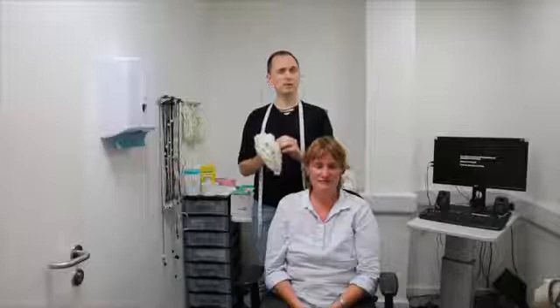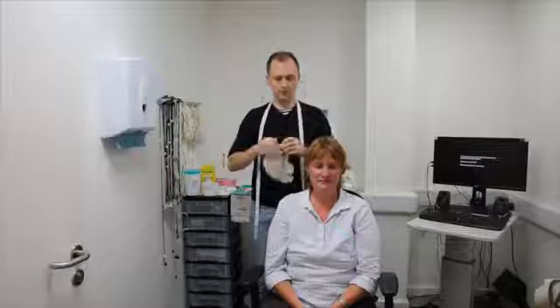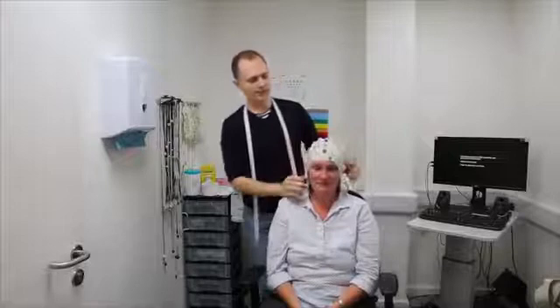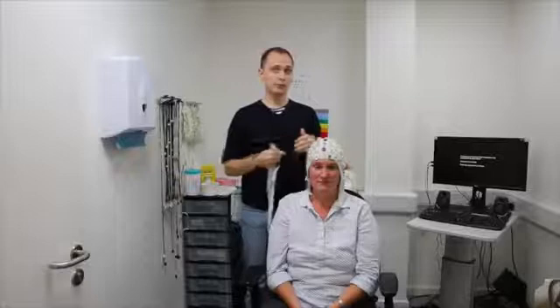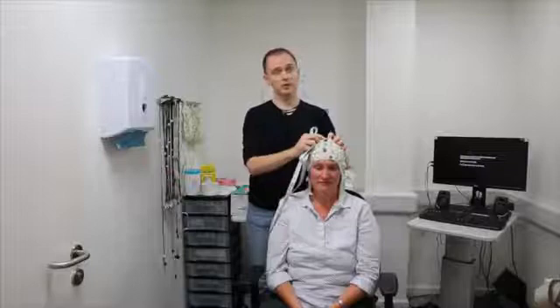You don't want to select a cap that's too big, otherwise it may be loose and bulge out in certain places — try a smaller cap to make sure it lies flat across the head. To position the cap, open it up, ask the participant to hold the front of the cap on their forehead, then pull it back over the head. The cap should fit fairly tightly and flat. There's a critical position point I want right in the middle — electrode CZ, usually labeled number 14 on most ActiCap caps.